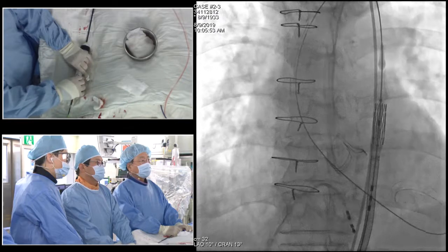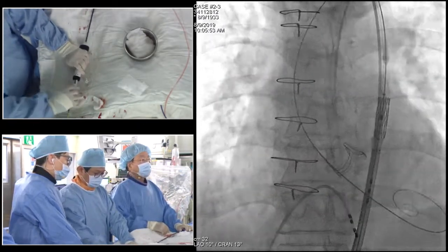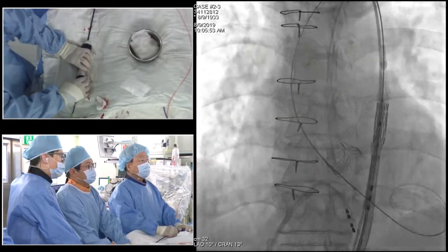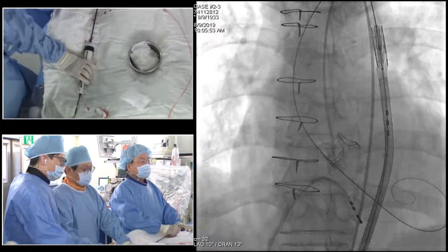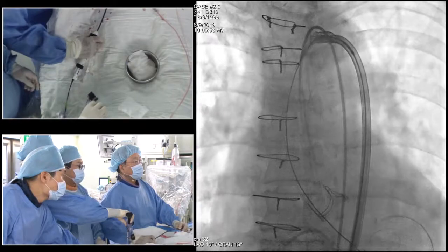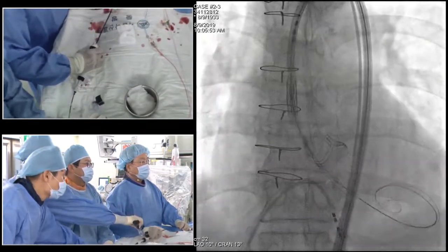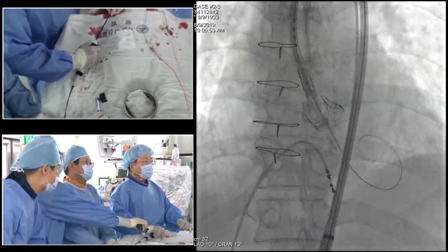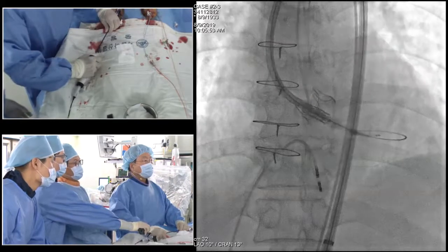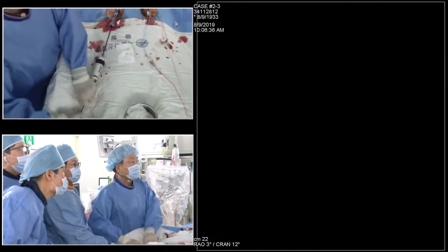Yeah, and we had a very heated discussion recently about this approach. Yes, it is an approach, but it is a fairly aggressive and fairly new approach. We don't know the long-term outcomes. So unless you need to do it in order to lower the gradient, why would you do it? Okay, but now we concentrate on the valve deployment. We'll talk about that after. I think it's a great question.